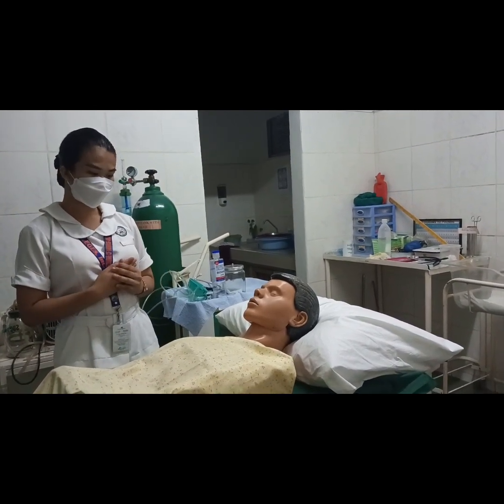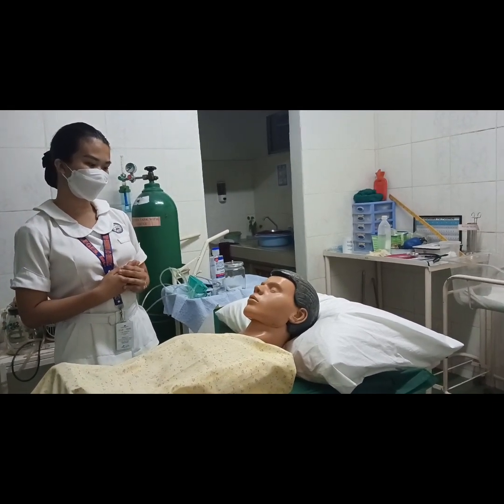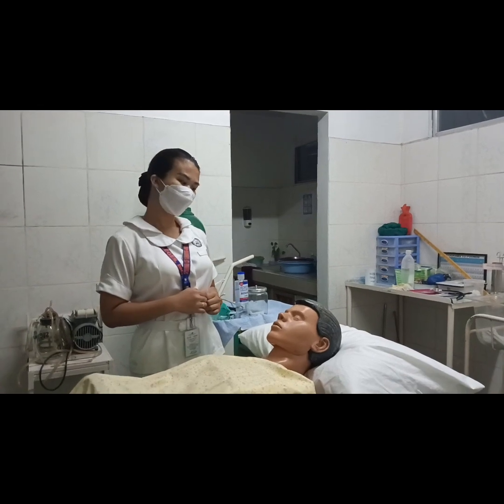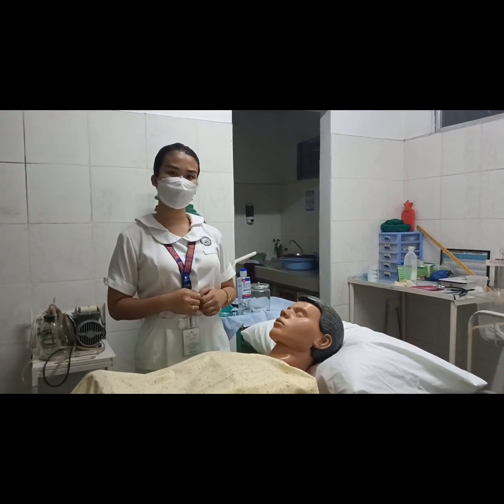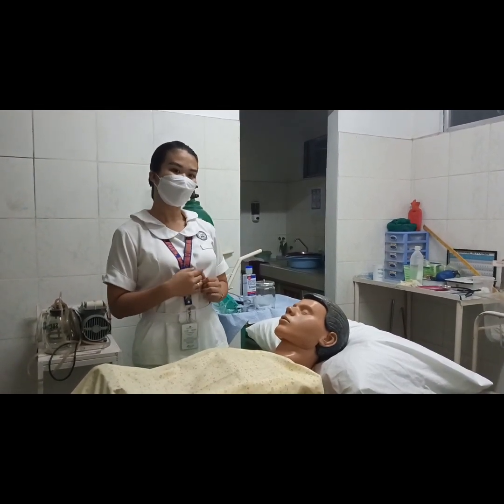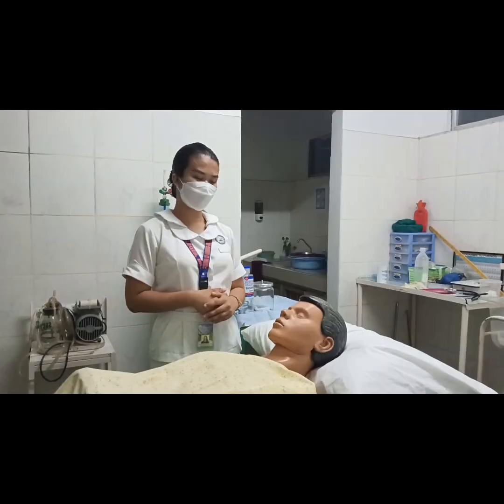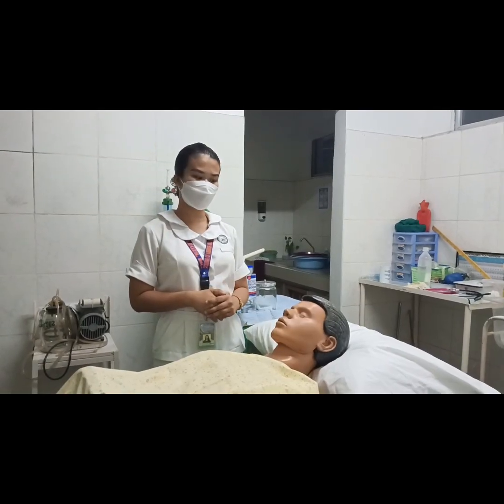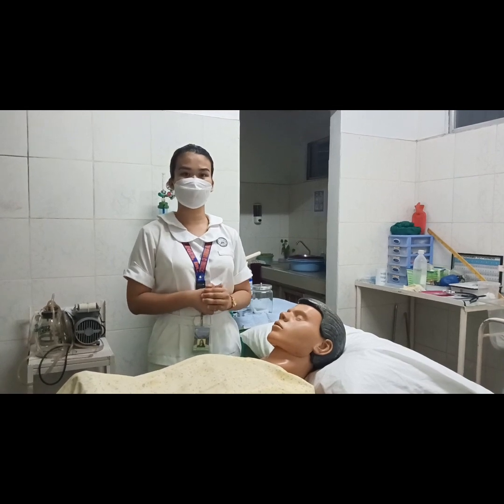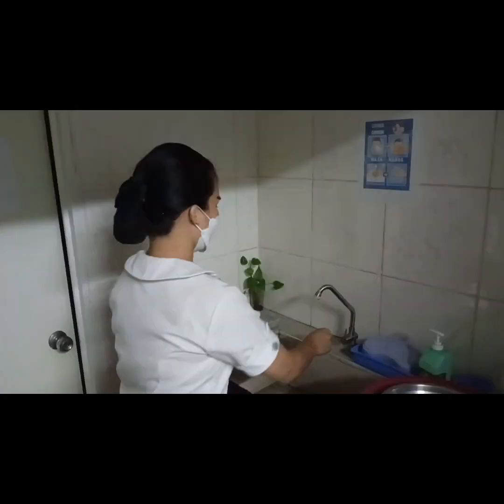I will check for any signs or symptoms of respiratory distress, and I will check the doctor's order to know the ordered oxygen concentration and method of delivery. Next, I will wash my hands to limit the transfer of microorganisms.